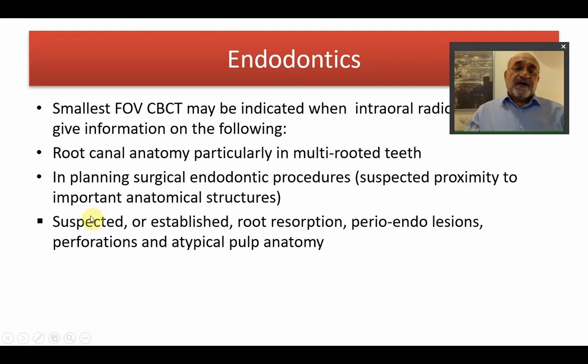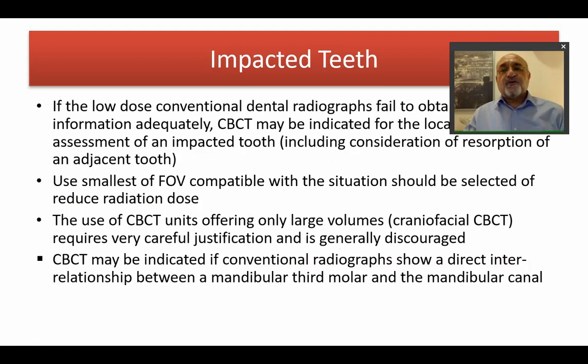So, surgeries and suspected root resorption, established root resorption, perioendo lesions in which you don't know which is the cause.